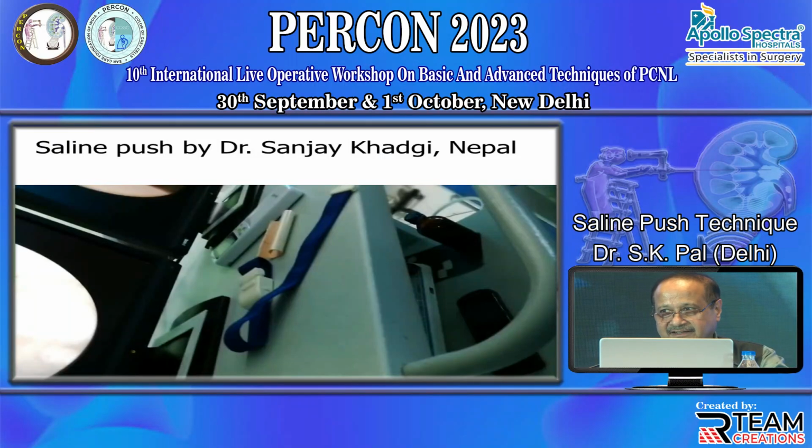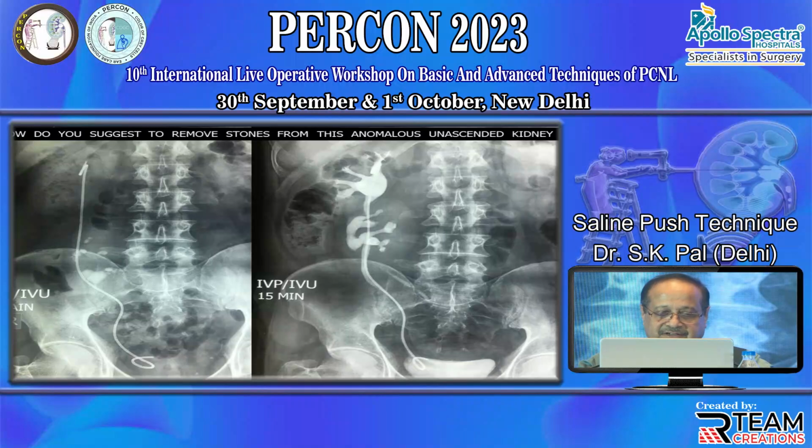By this technique, if you master, there is no need of doing, no, I will not say, maybe reduced, nephroscopy or ECIRS. All those are not necessary if you learn this technique. This situation which I showed you, there are 2 stones in the superior, 2, 3 in the middle and so many in the inferior. This is the kidney.